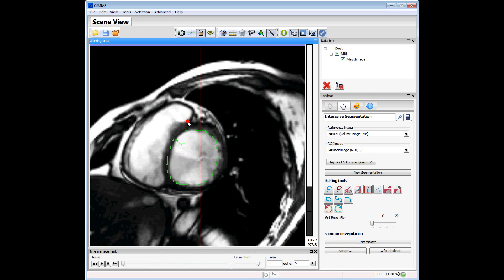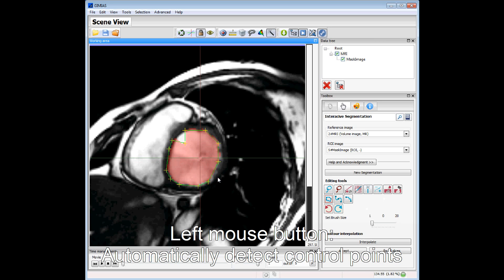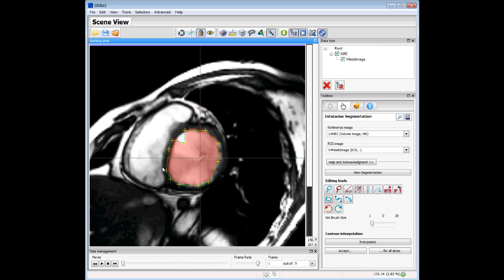We move the mouse to adjust the region, and when satisfied we press the left mouse button. We deselect this option and click on the polygon tool again, click left mouse button over the image, and we can see the control points are automatically computed. We can easily remove a point and press Space to paint the inner zone. This tool is very easy to combine with the rest of the segmentation tools.